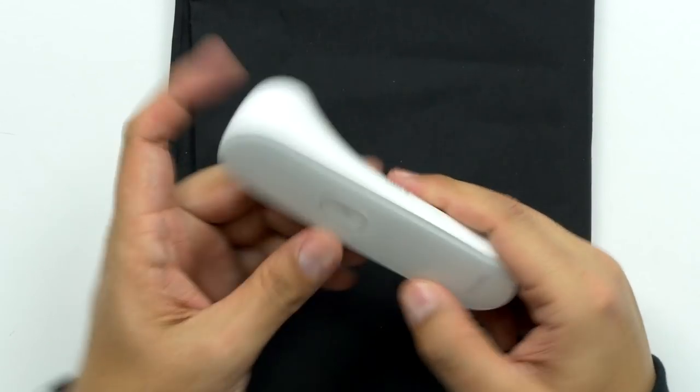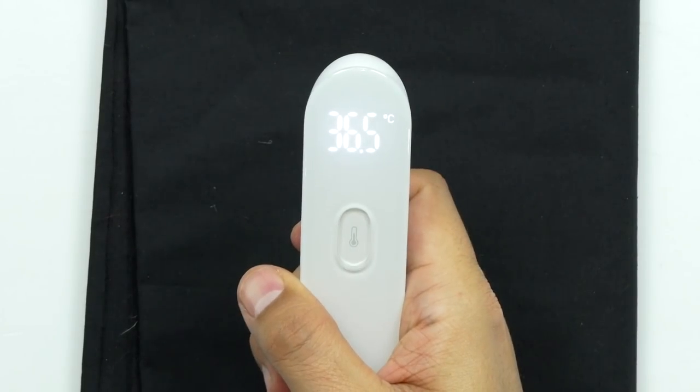As simple as it sounds, this is one of those tools that we take for granted. Everybody has one in their house. I didn't actually expect it to work in one second. It's like a barcode for your forehead because you're supposed to aim it at your forehead. Let's see what it does on my neck — same thing, 36.5. Wow, it's really working. Let's do a test. I'm going to make sure. So it says it's like 36.7, 36.8 degrees centigrade, which is like 98 degrees. Let's just see how accurate that is.